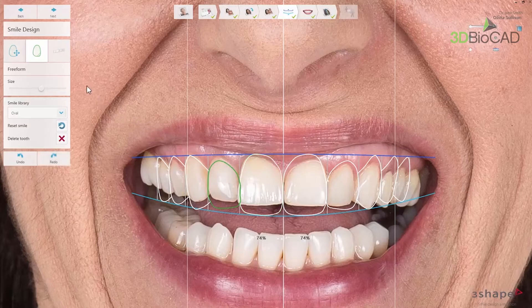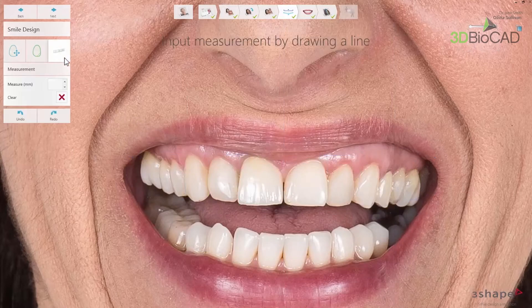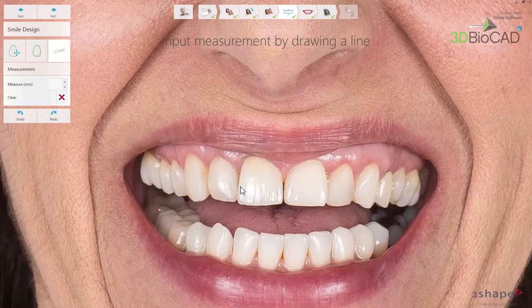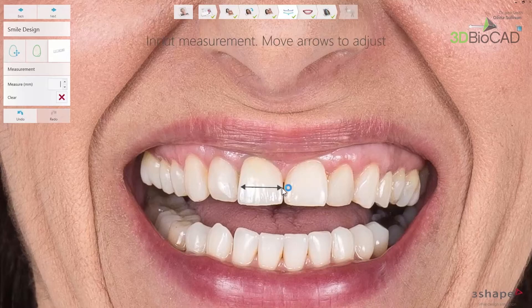The measurement tool enables you to add measurements of the existing teeth. The measurement can be used as a reference when you do the smile design and as input for making the mock-up model. Place the arrow where the measurement has been taken and input the value in the measure box.